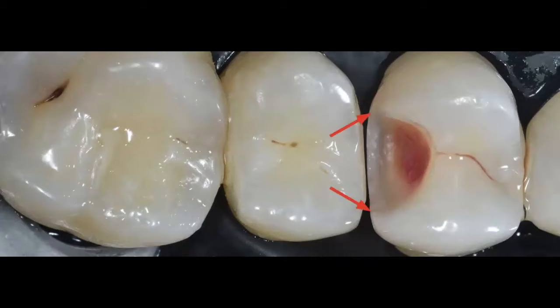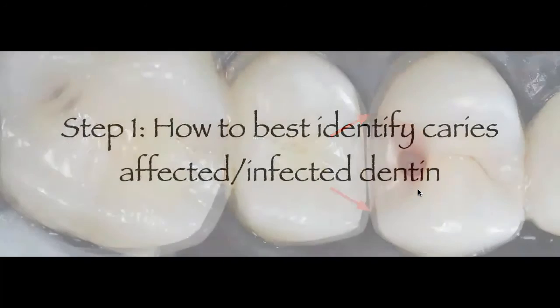And again, you can see the walls that I was able to bevel at approximately 45 degrees, cutting through that using a thin, medium grit diamond mosquito burr, just a very thin mosquito burr that you would have in a kit like a porcelain veneer kit, just to make sure that you can get in those areas. And again, by creating that separation with the wedge, you protect the neighboring tooth from any nicking.